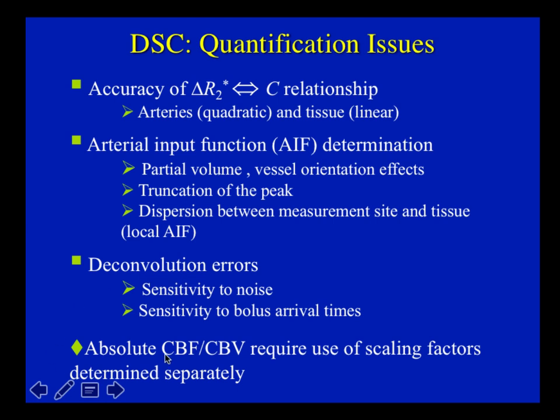If you want the absolute CBF values, then we need to acquire additional data so that we can actually determine the proper scaling factors to correct for the errors, and these scaling factors need to be determined separately.